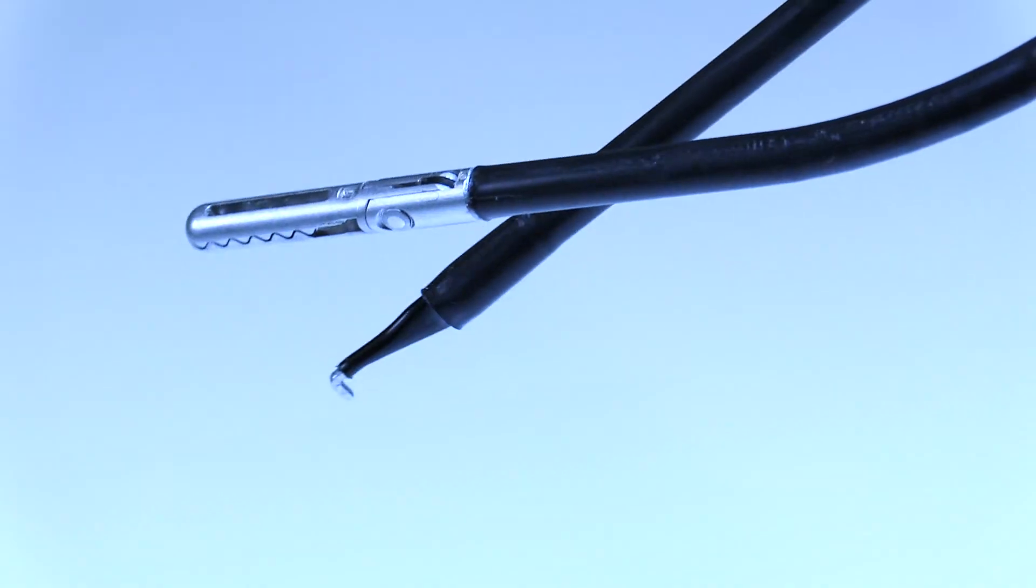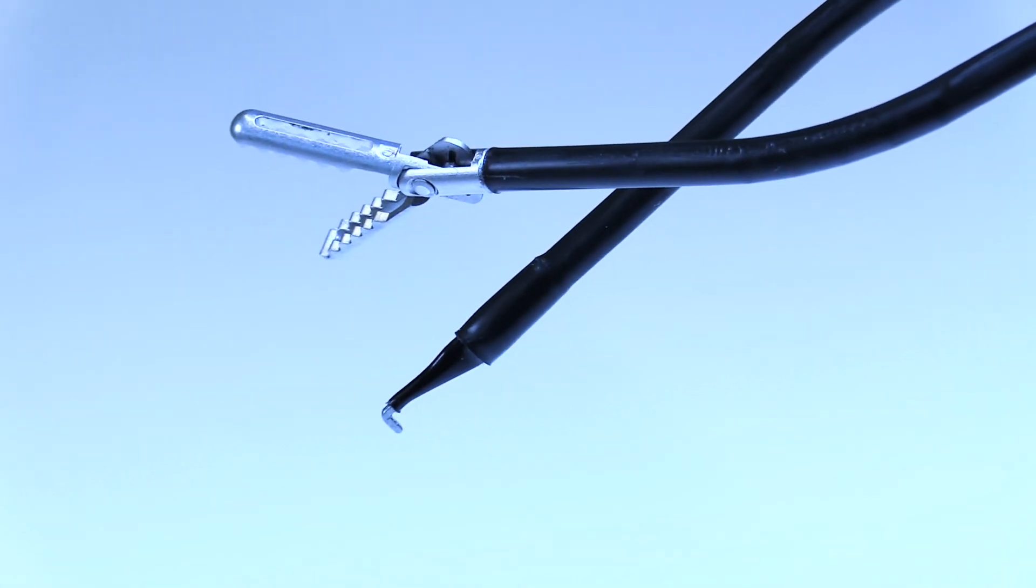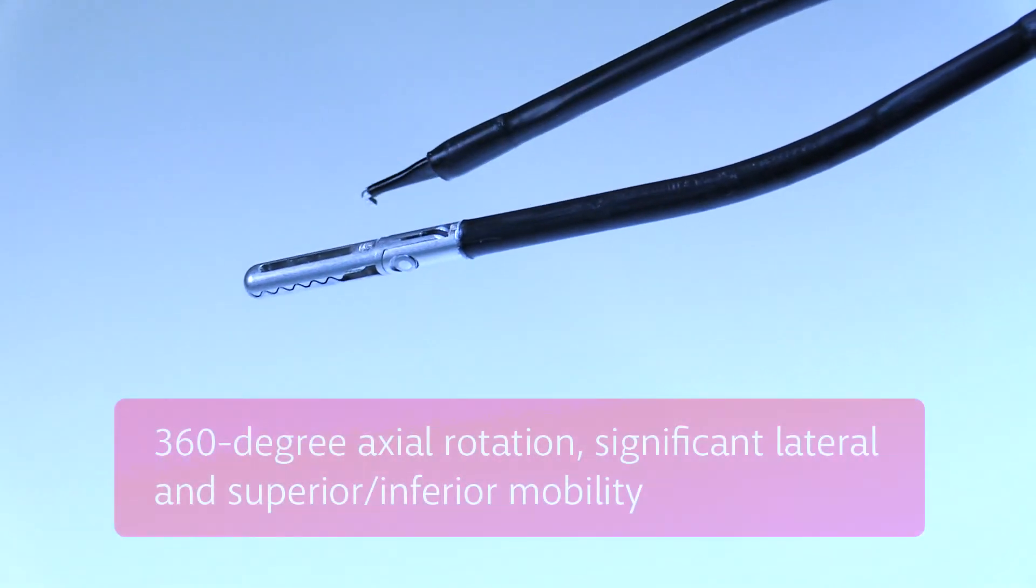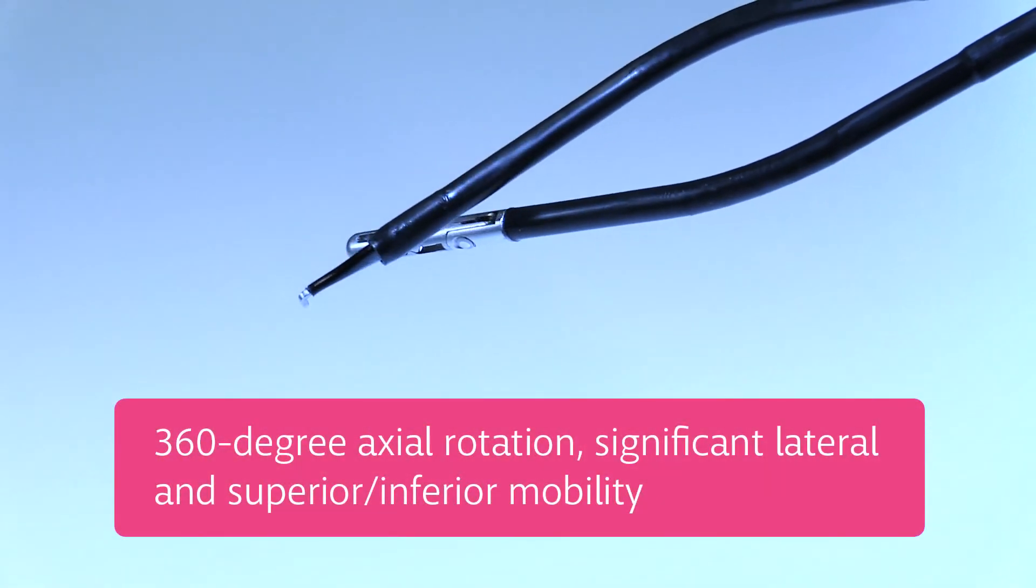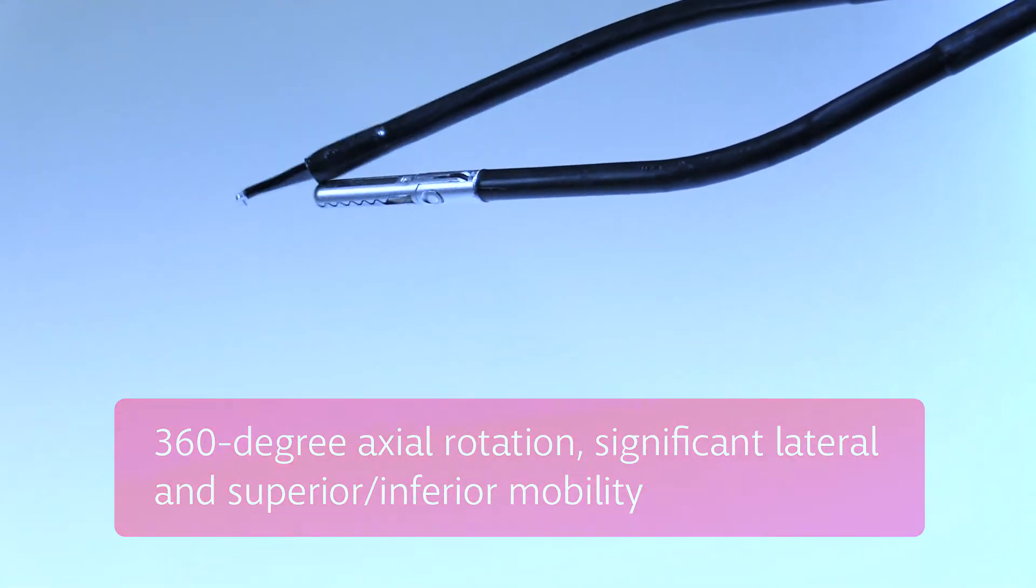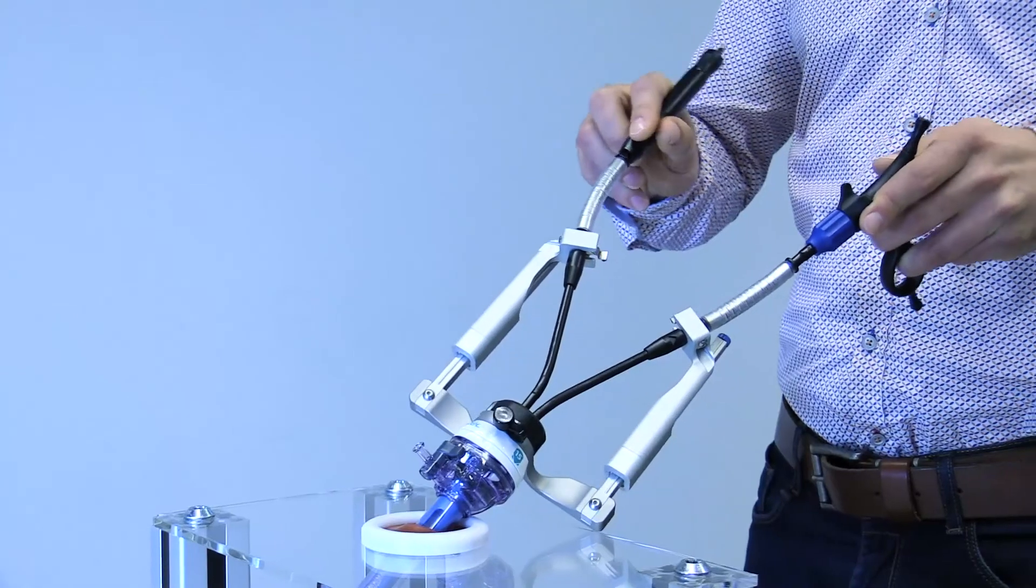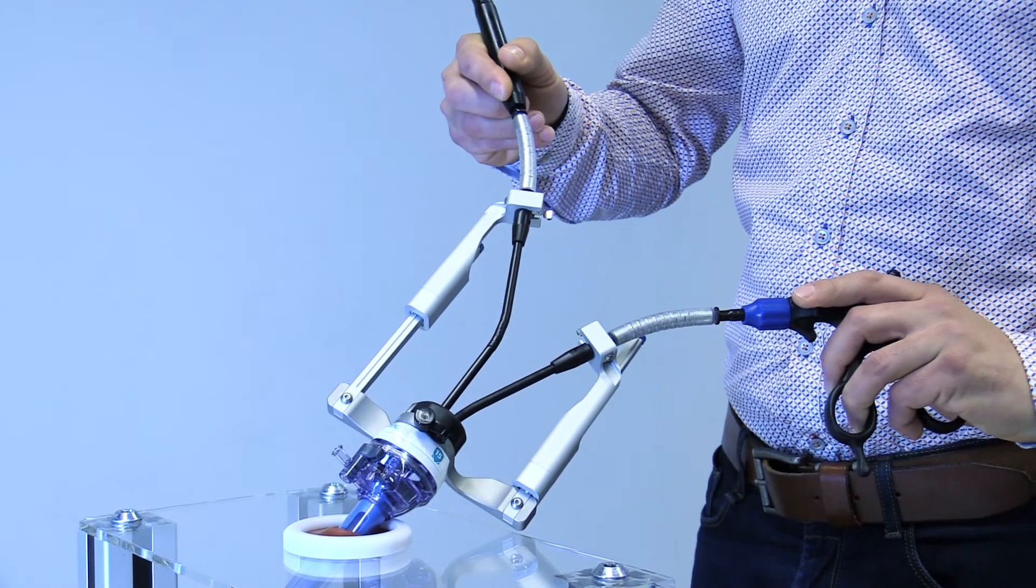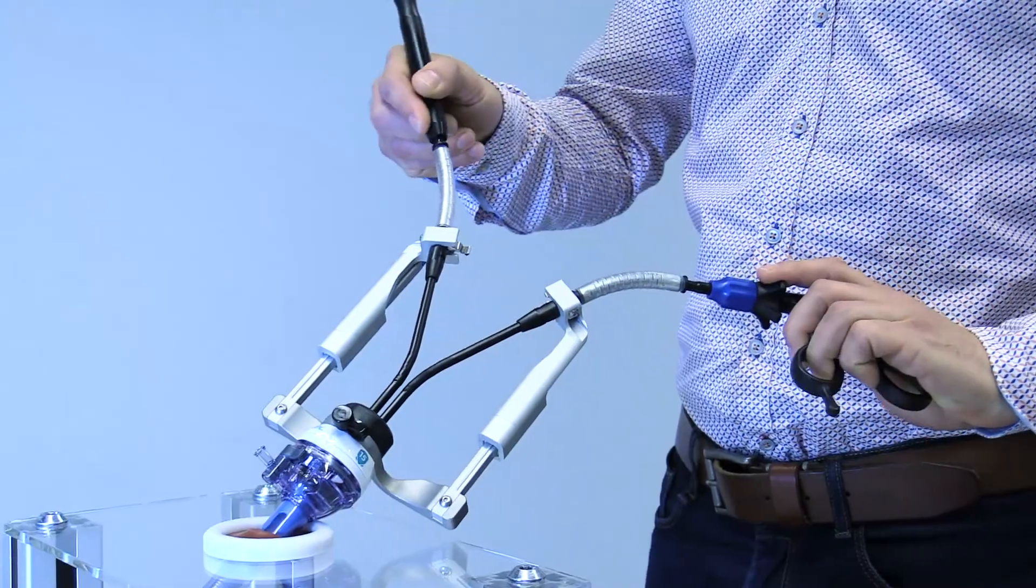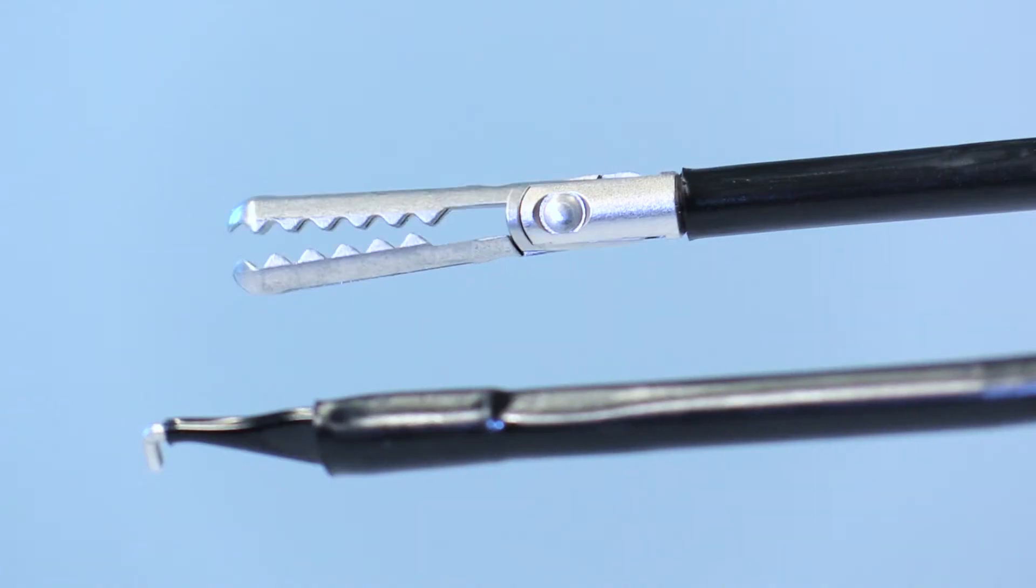Each instrument is capable of 360 degree axial rotation as well as significant lateral, superior, and inferior mobility. Together, these instruments provide excellent triangulation and range of motion, allowing for delicate and precise tissue retraction and exposure. Even knot-tying can be performed successfully and with ease.